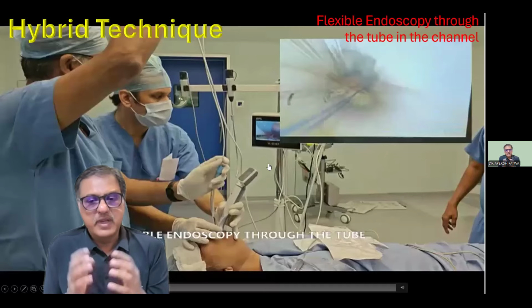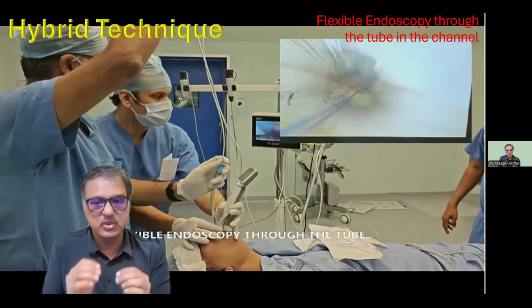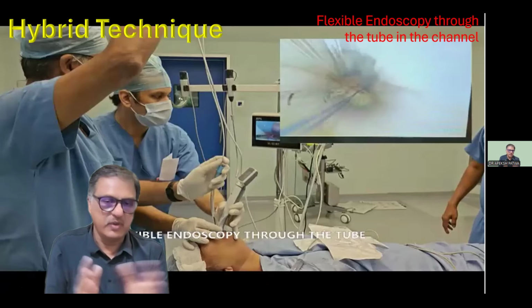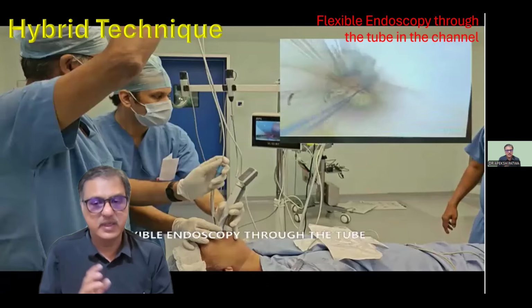Now, many times, in spite of doing a lot of maneuvers, you are not able to negotiate the endotracheal tube inside the larynx with the channel blade. Either it is going down into the esophagus or impinging somewhere over the larynx. So what to do then? Then you have to apply a hybrid technique.